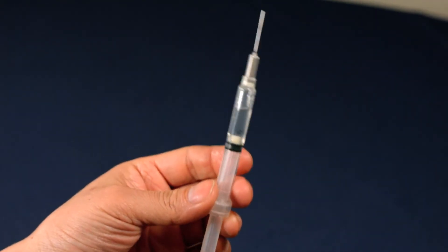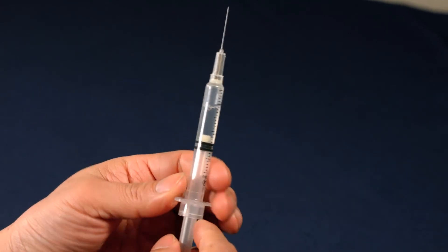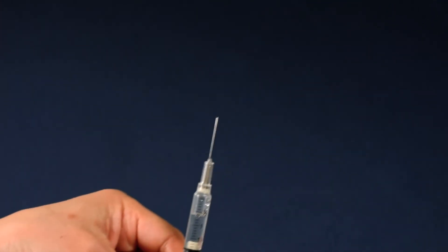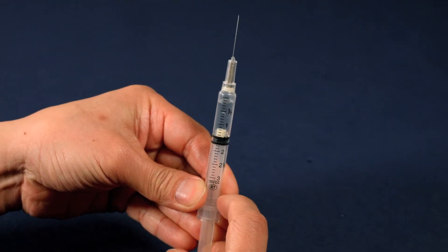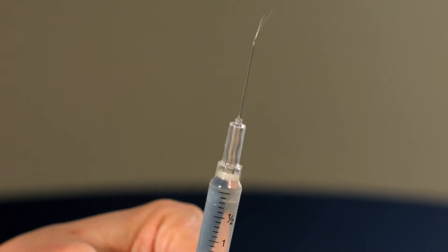Hold the syringe at eye level and tap the barrel to remove any air bubbles. Expel any air by pressing the plunger until a drop of liquid forms at the top of the needle.